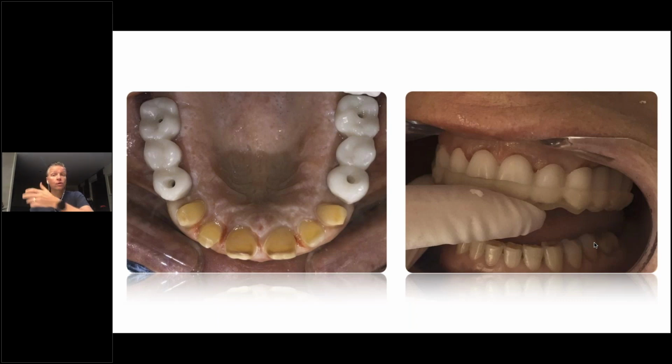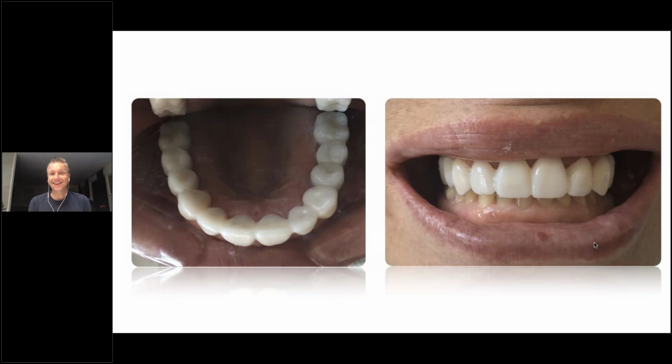That's very important. Of course, the implants were helpful here because they don't move. They're just there. And here is the final seating, the final smile. Now we can evaluate. You see it still looks a little bit horsey, because the upper anteriors are now big and the lowers are so tiny.